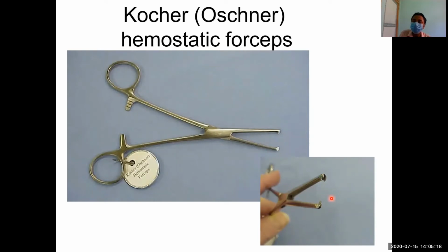It is a very tough structure, and it needs great force to pull it together and suture it. So we can use this instrument to hold the scalp, to hold other tough structures like the medial meniscus, lateral meniscus in orthopedic surgeries, or even the linea alba. But we remember that this is a traumatic forceps, very traumatic, so some amount of tissue damage will be there. So for retractile vessels and tough structures, we will use the Kocher's hemostatic forceps.